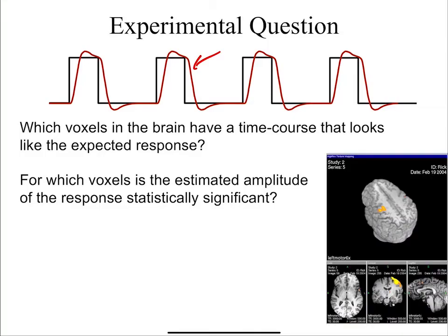And then at the end of the day, I want to create a map. In this case, it's a thresholded map shown on a 3D display. So that's what we're really going to talk about today. Some of this will be review for some of you, others it might be newer.